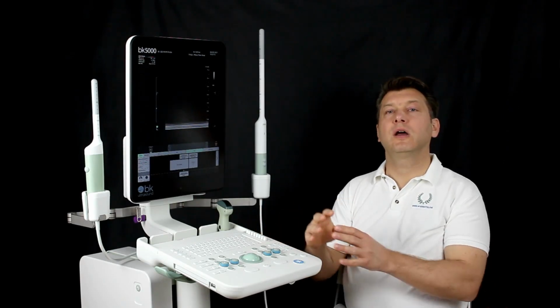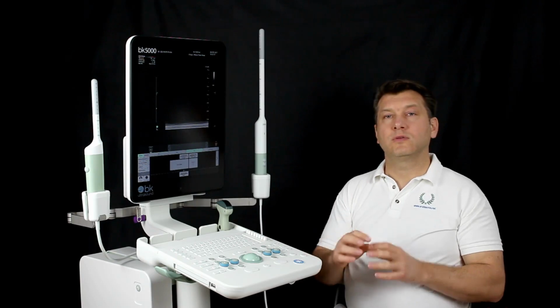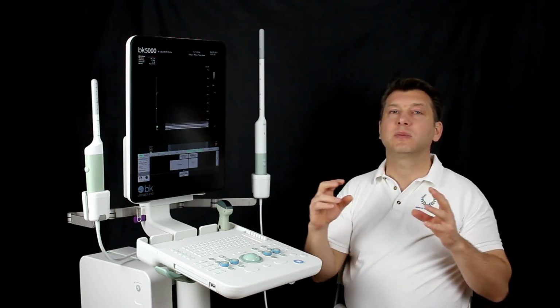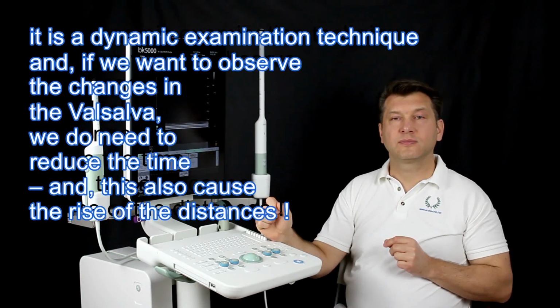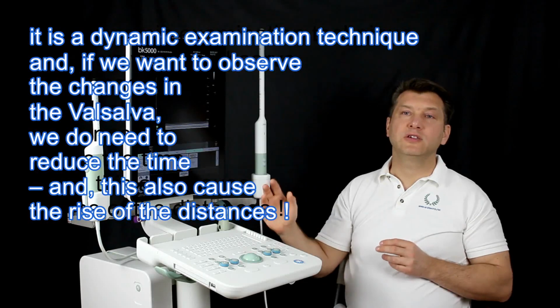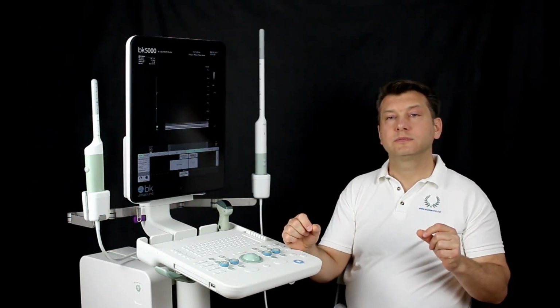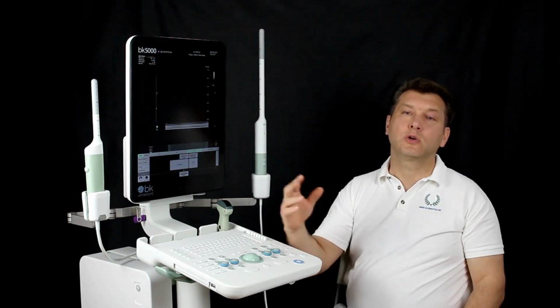Distance 0.5 until 0.75 millimeters. The choice of a fairly large distance of at least 0.5 millimeter is justified by the fact that this is a dynamic examination technique. If we carry out this examination at rest, the distances can also be chosen smaller. This automatically leads to an extension of the recording time.